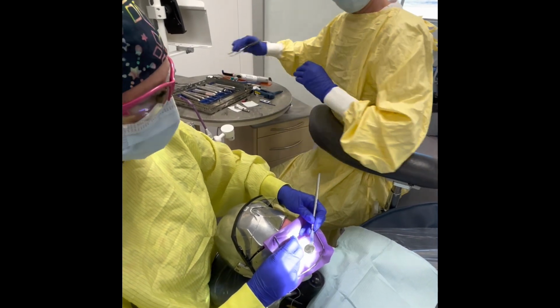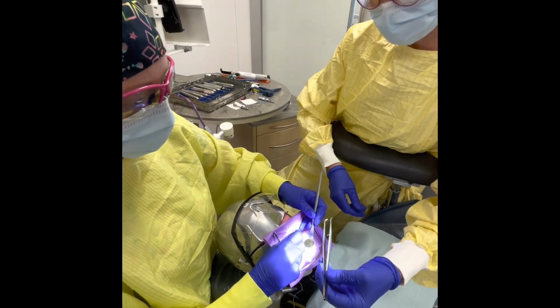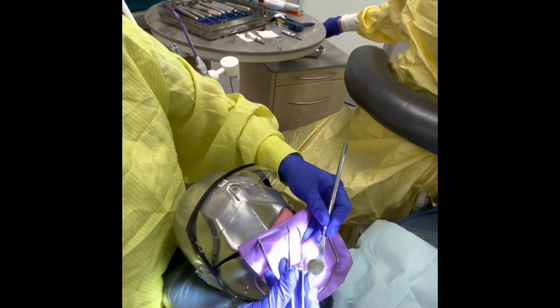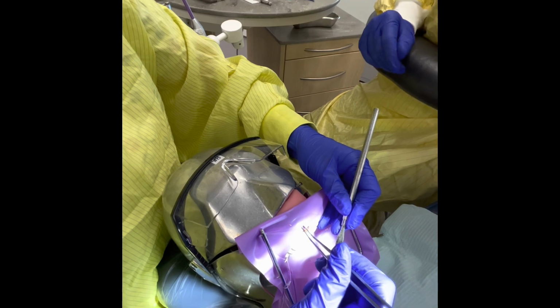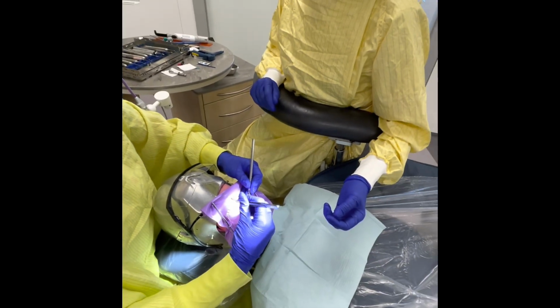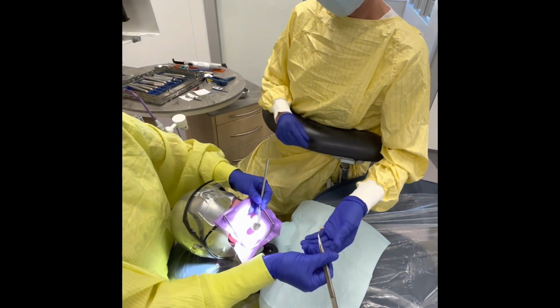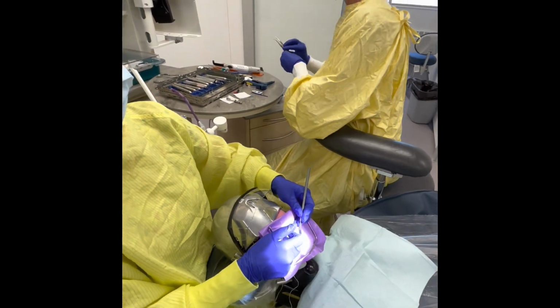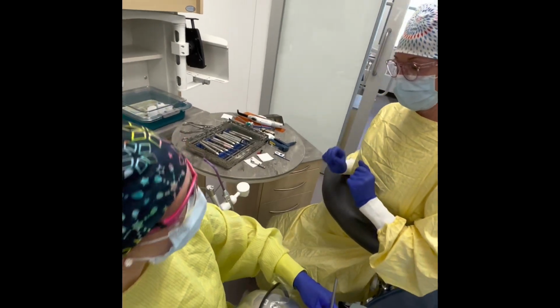I'm going to pass her the intraoral. I'm going to remove the strip. Okay, I'll take that, and then I will have my pliers, my intraoral pliers. I will remove my wedge. Palm it to Stacy so she doesn't lose it there. And Stacy's going to take it and put that in her kidney basin so we don't lose it.